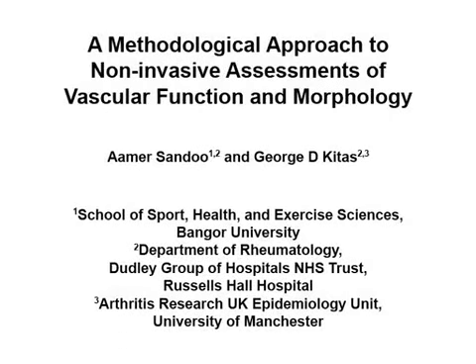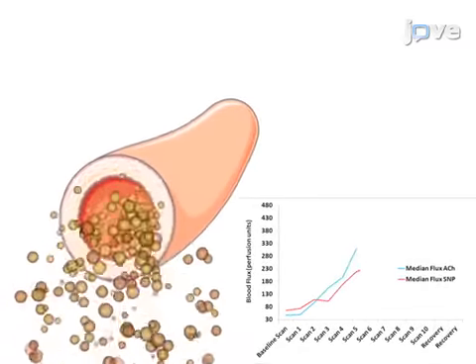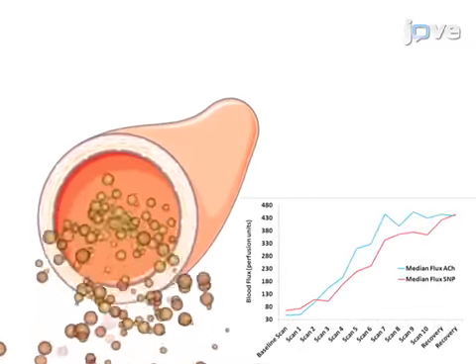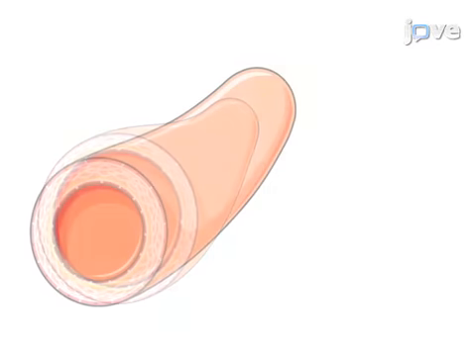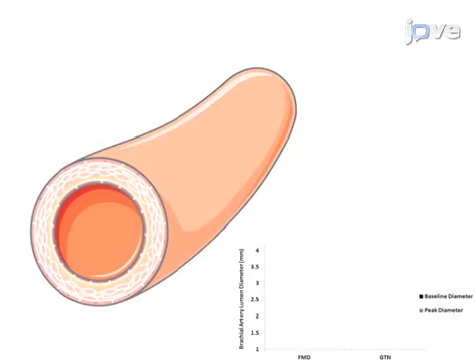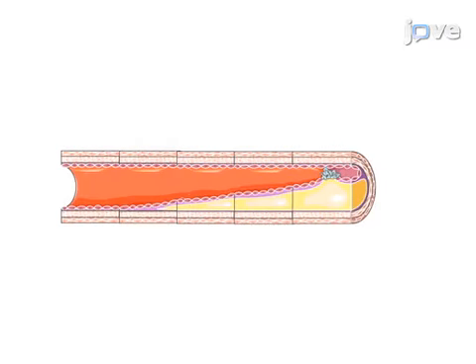The overall goal of the following experiment is to examine subclinical atherosclerosis in different vascular territories. First, laser Doppler imaging with iontophoresis of vasodilating drugs is used to examine microvascular endothelial function. Next, flow-mediated dilatation and glyceryl trinitrate-mediated dilatation are used to examine large vessel endothelial function. Lastly, the carotid intima media thickness is analyzed for advanced morphological changes.